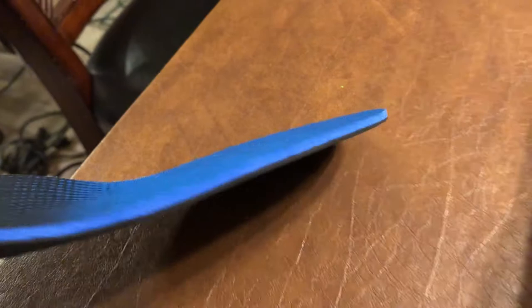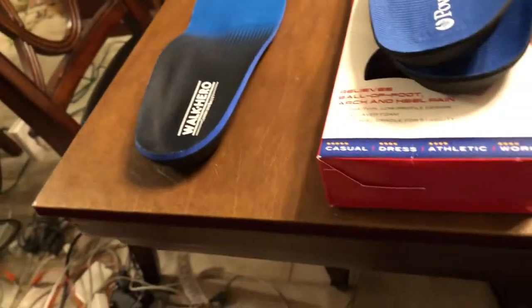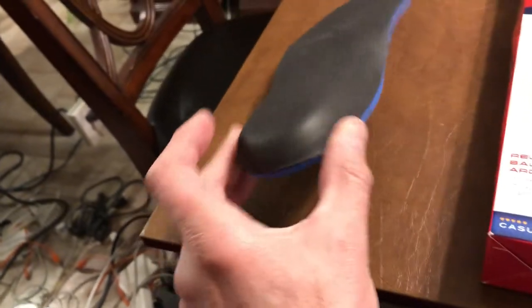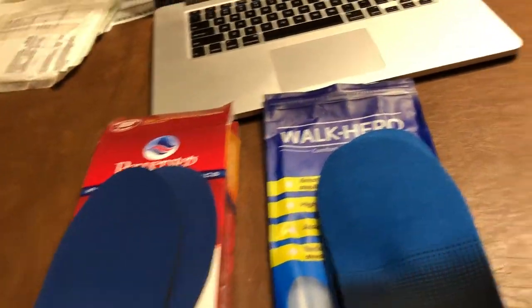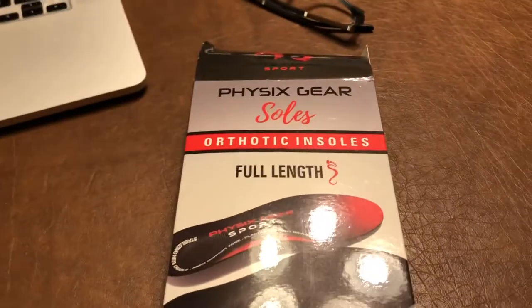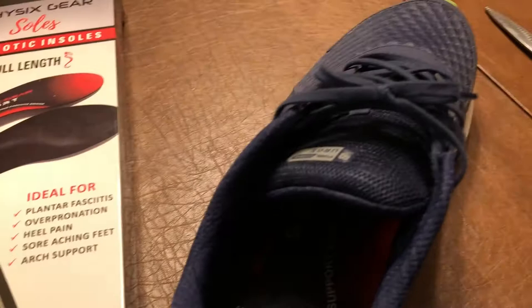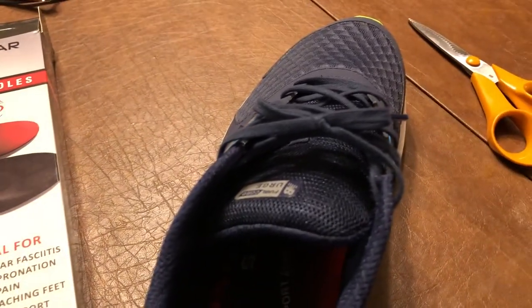Walk Heroes are just a hair thicker overall — basically as thick as Superfeet — and you might feel like you're going to come out of your shoe, almost like those old height-boosting insoles. I do like the square bottom of the Walk Heroes to prevent side-to-side slipping. In summary: Power Steps are good for medium-high arches, Walk Heroes same, and for a seriously high arch try Physix Gear. All three should feel as good as or better than Superfeet.